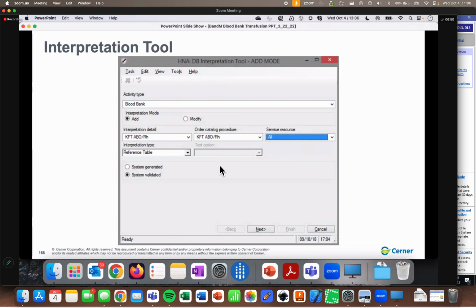And therefore, if you do have some situation where the tool closes and you need to get back into it, you have to go into modify mode. Just like any of the other tools that we use, where if you're building new, you click the new button. If you're updating existing, you click the open or modify button, right? So it's just like that. It's just something about this particular tool. People have a lot of mind blanking moments, I guess.